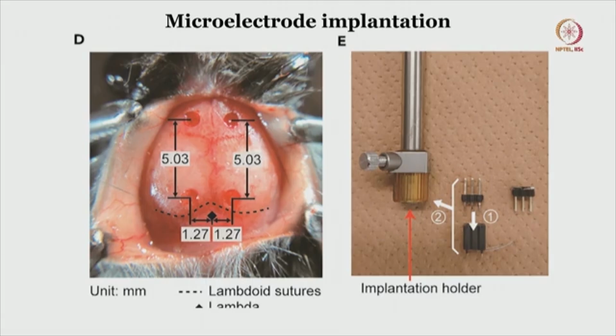From the surface of the brain, they are going to record electrical signals based on various behaviors that the rat performs, and more importantly, when a seizure happens, either by instilling seizure-inducing agents like bicuculline, you are going to see the seizure manifest physically. The rat will go into a seizure, and when the seizure happens, these implanted electrodes will record it.